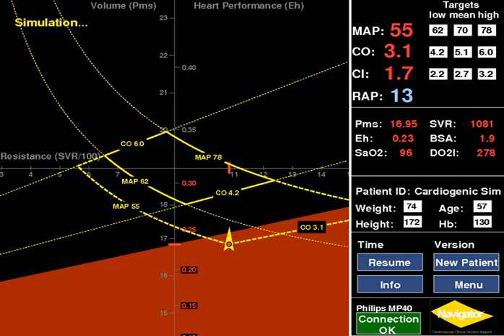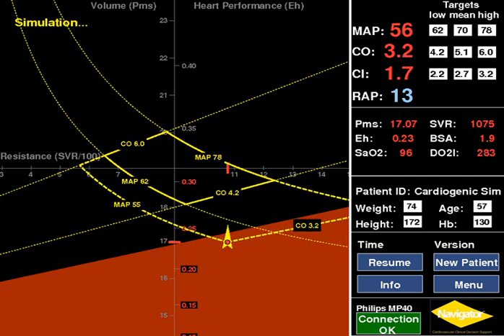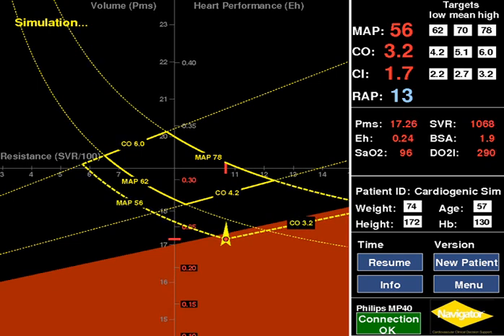The actual events displayed in the graph took place over a number of hours. The patient status is located below the PTZ and in the red zone, as their DO2I is less than 300. The numbers on the heart performance EH scale are also labelled in red, indicating a critically low cardiac performance.